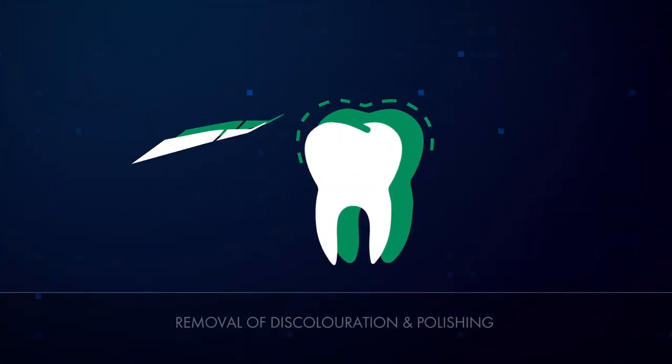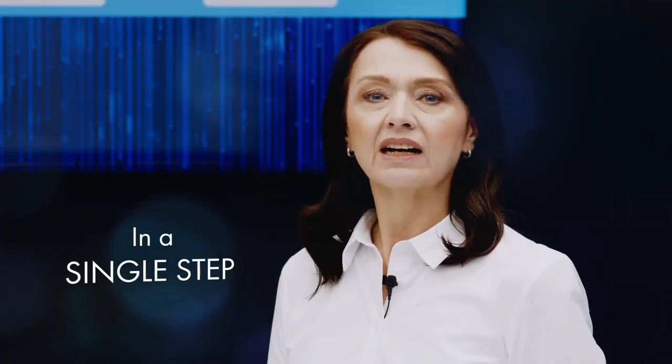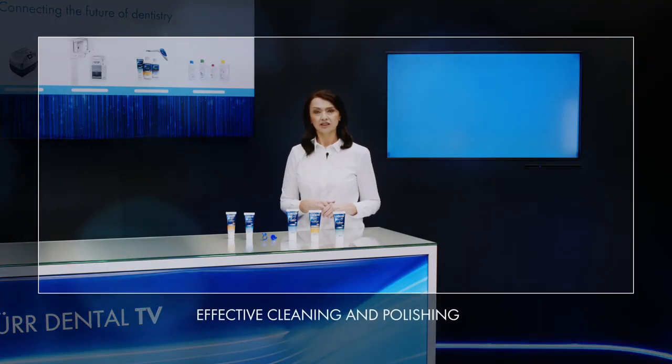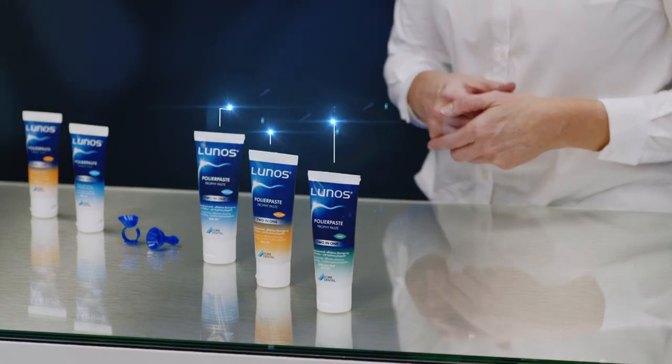The fourth step in the process involves removing extrinsic discoloration and polishing surfaces. This is where the myLunos powder jet unit comes in, or, as an alternative, polishing with suitable Prophy paste. The Prophy paste 2-in-1 cleans, removes discoloration and polishes in just a single step. Rod-shaped silicate particles are reduced during the cleaning process, resulting in a smooth reduction in abrasiveness — from cleaning to polishing in just 10 seconds. This cuts down on the time-consuming task of polishing with pastes that have various degrees of abrasion. The Lunos 2-in-1 enables effective cleaning and polishing thanks to an innovative system of abrasive and polishing agents. It's highly gentle on tooth substance, with an RDA of 28. Hydroxylapatite also supports remineralization. The consistency of the paste allows it to spread easily with practically no spray.